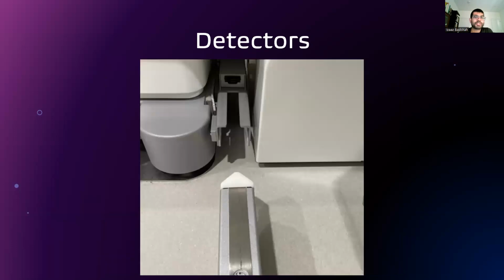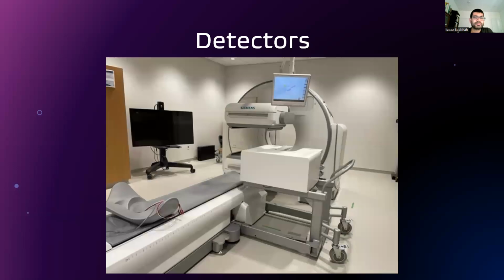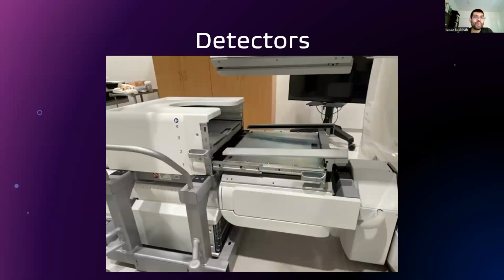To perform a manual change, bring the collimator cart through the track near the far end of the patient bed and gently push the cart in. Once locked into position, use the handles to pull out the collimator until it is fully extended and push the empty housing back in when directed.